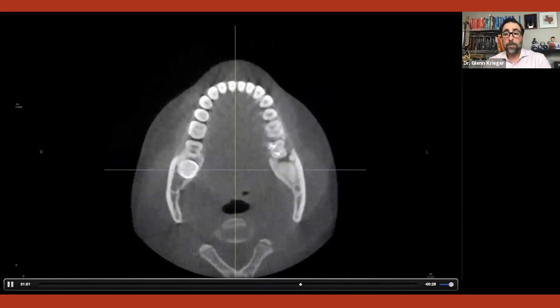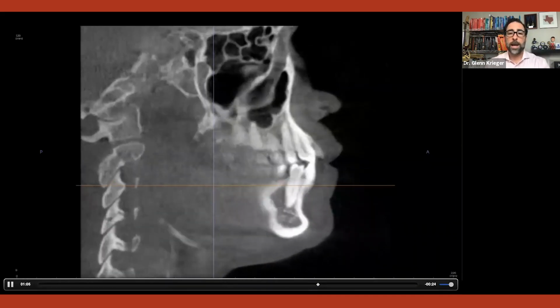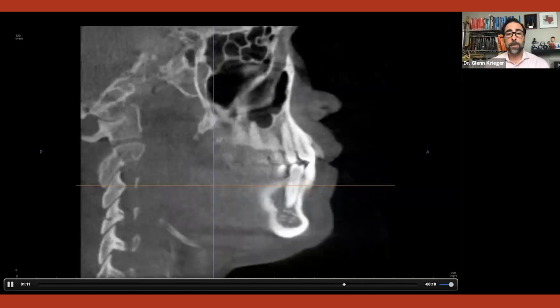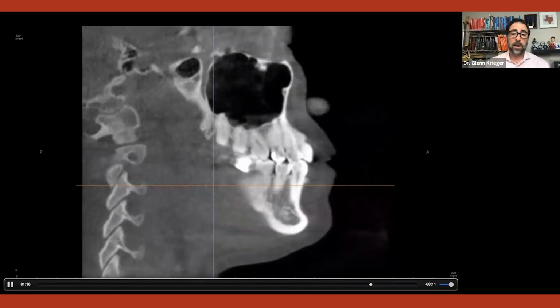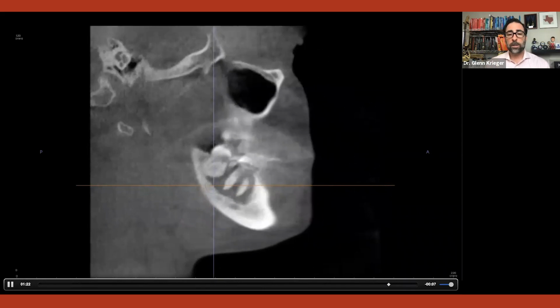It's not going to necessarily help me with ortho a ton, but again, I'm going to come back to the question: who are we trying to help, ourselves or the patient? Are we trying to give them better care? There are going to be cases where I'm going to help them get better care and it won't involve me on any level. But I can avoid bigger problems if there's a cyst, if there's a growth, or something they wouldn't have seen otherwise.